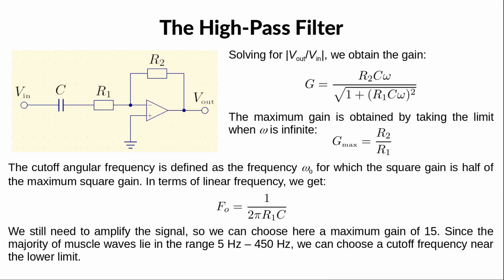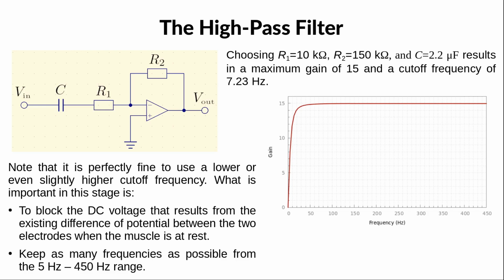Since we still need to amplify the signal, we can choose here a maximum gain of 15, and since the majority of the muscle waves range from 5 Hz to 450 Hz, we can choose a cutoff frequency near the lower limit. So here I choose R1 equals 10 kilo ohms, R2 equals 150 kilo ohms, and C equals 2.2 microfarad, which results in a maximum gain of 15 and a cutoff frequency of about 7 Hz. This is perfectly fine, as the important thing is to get rid of the DC component without losing too much of the 5 Hz to 450 Hz frequencies.